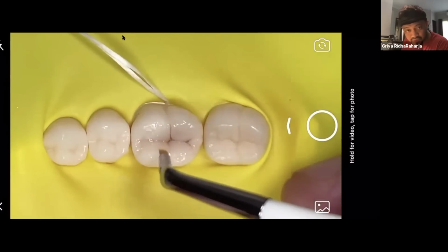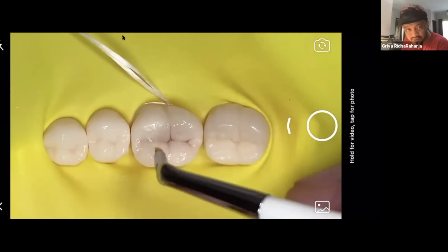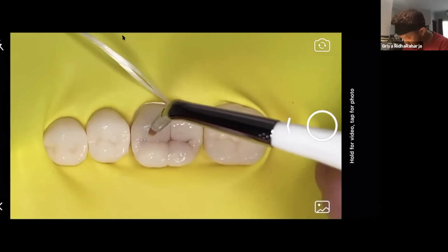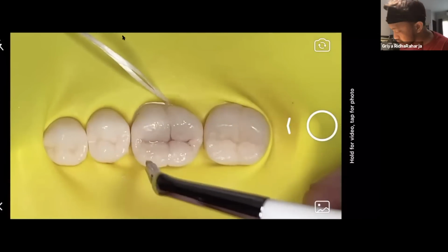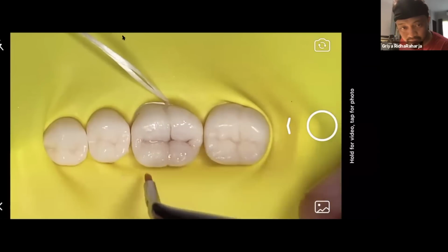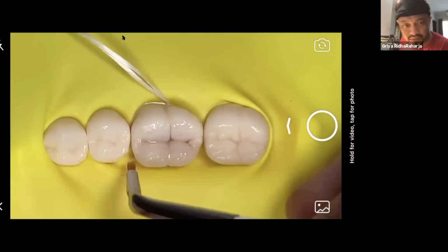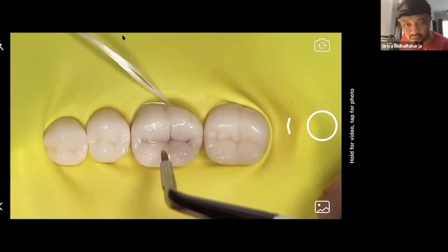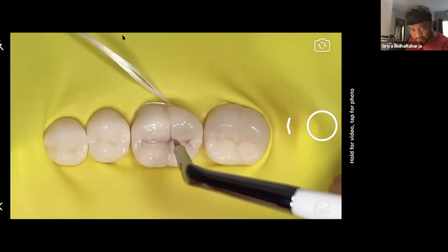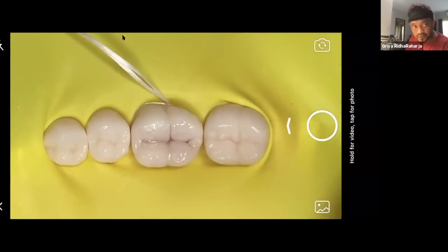Brushing, brushing, brushing. You can see in the Rizal videos, he's always brushing. See, from the middle to center. Don't go from the middle center and then push back to the center. No, in out, in out, in out, like that. Yeah.